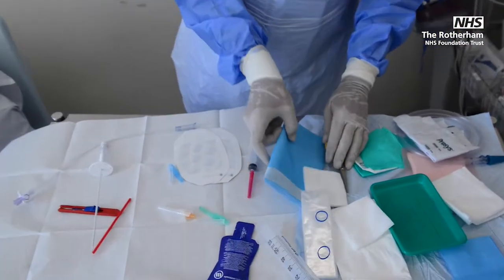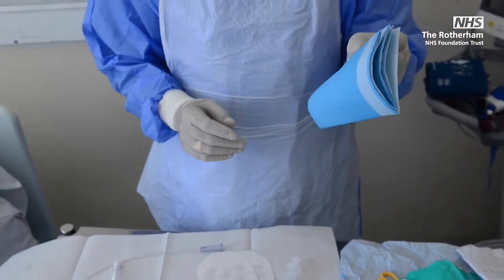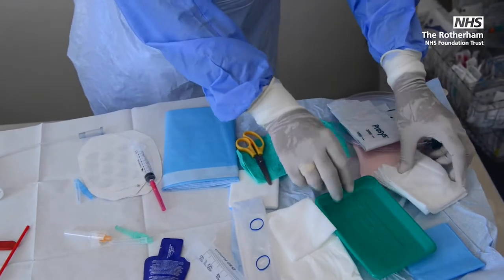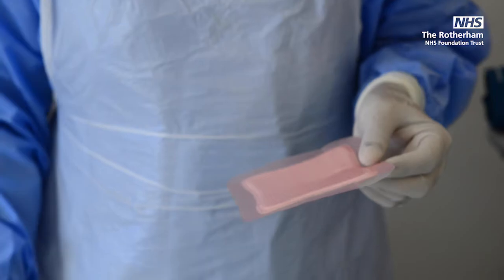And then we have got the blue drape that has to cover once you have sterilized the area. And then this is to cover that. And then you've got the scissors and a catheter bag. And for the final dressing, it's a leave-in dressing that has to go on to attach this drain.